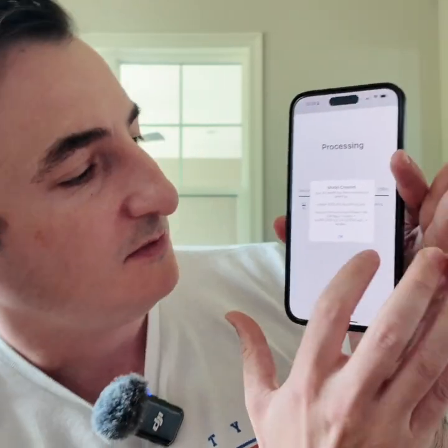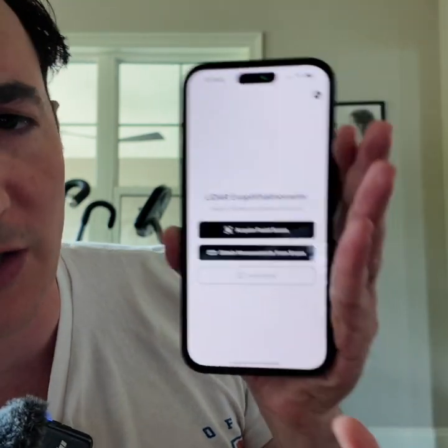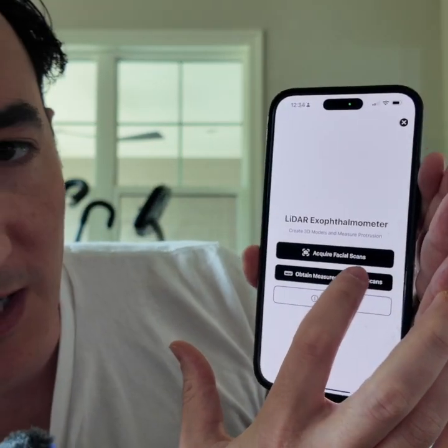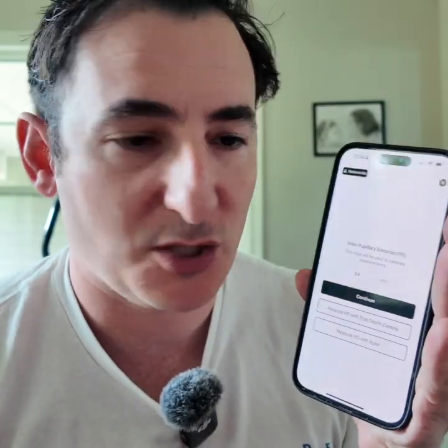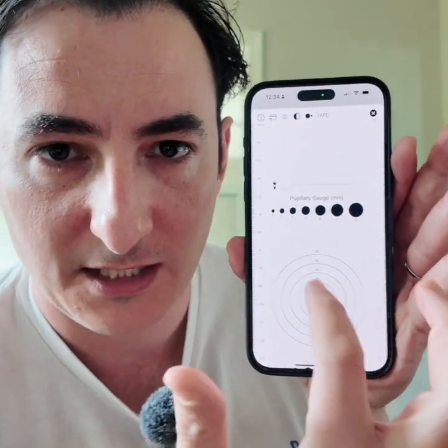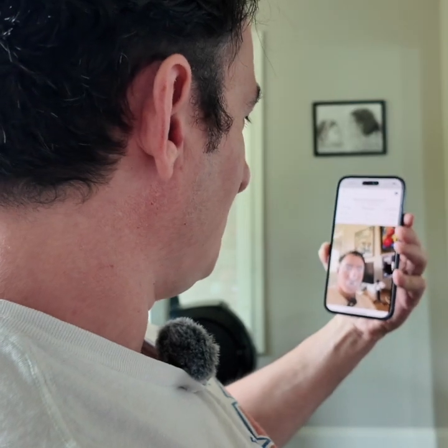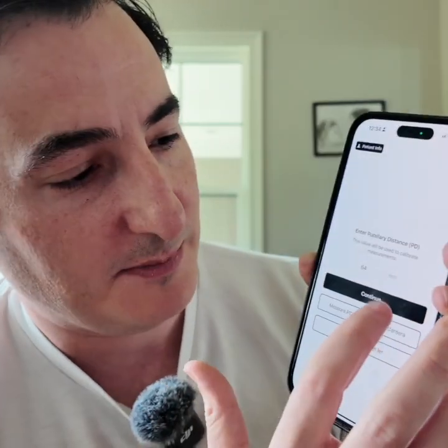You'll see now it's saved. I tap okay. It gives me the option to take another scan, but I'm going to close that, and then tap 'Obtain Measurement from Scan.' You put in the pupillary distance — this is to calibrate the measurements. You can measure that with a ruler on the side, or you can tap 'Measure with True Depth Camera' to find the PD. The PD for me is 64, so I type 64 here and tap continue.